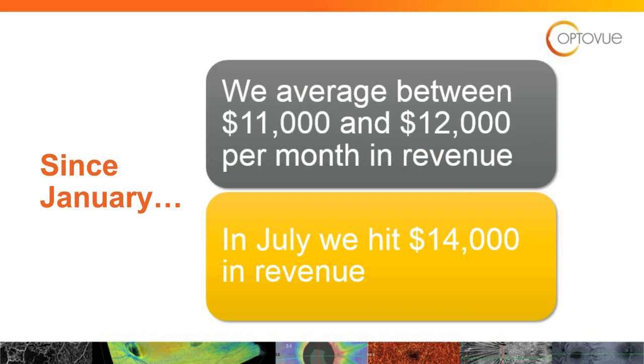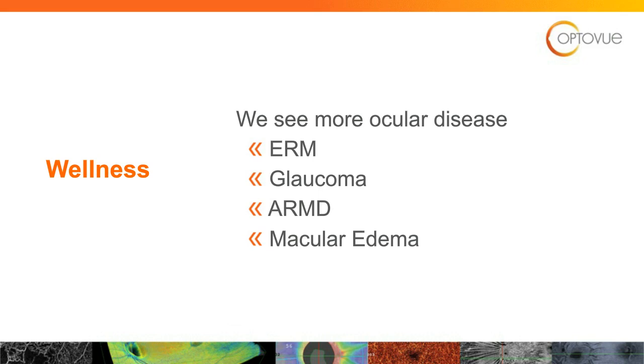So we see more epiretinal membranes, we see more glaucoma, we see more macular degeneration, we see more macular edema, things, subtle cases that are difficult to tell clinically.